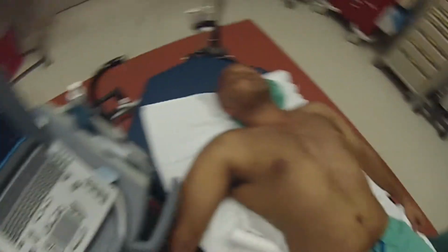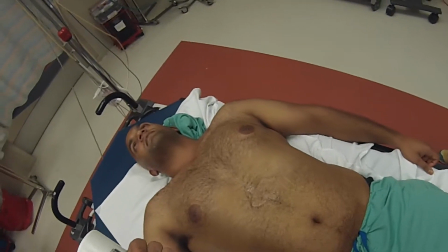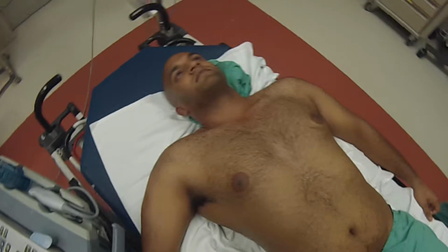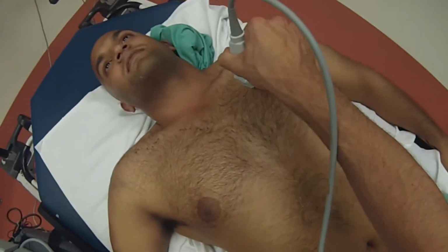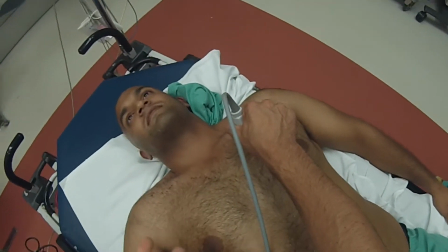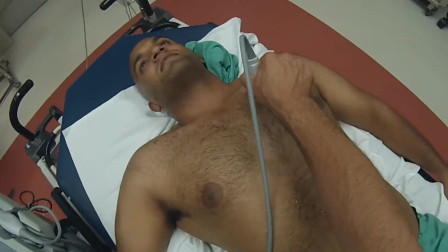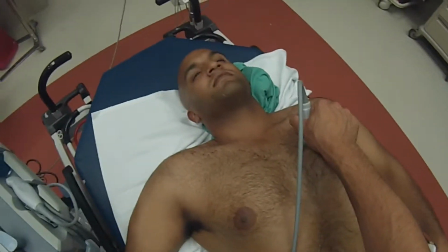We're going to rule out pneumothorax very quickly. Of course, our scan has already evaluated the two lower parts of the hemithorax for fluid in the right and left upper quadrants. Now we're going to look for pneumothorax, and we're going to start in whichever side of the chest is most affected in the trauma, right? If they've got bruising or pain on one side, you want to start there to get the information earlier. But there isn't a true protocolized left or right to start with. Just start where it makes sense.